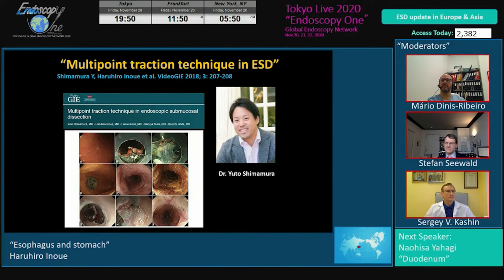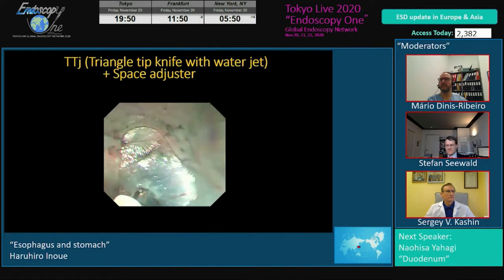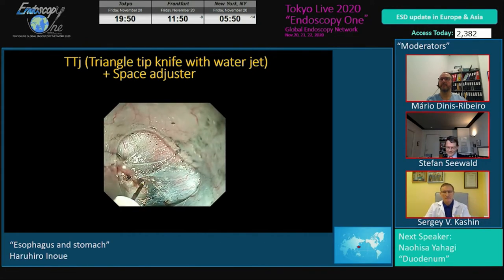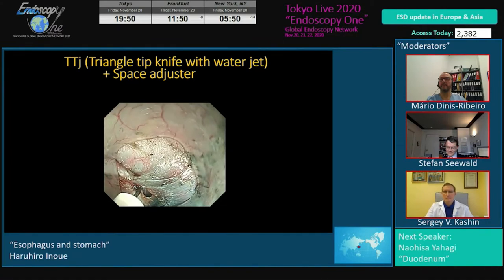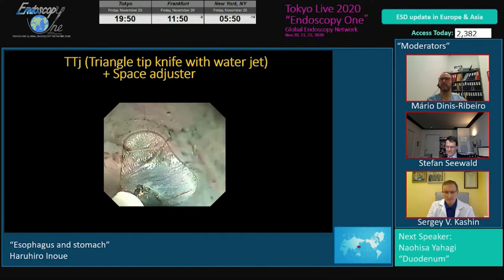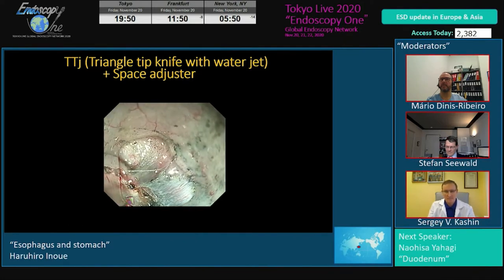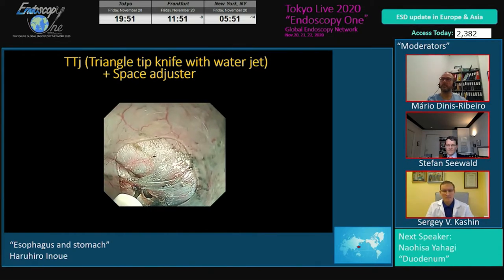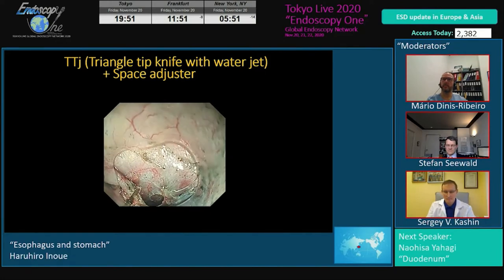Recently, the marked advancement of the ESD technique is using traction. In our hospital, we use a technique of multi-point traction. In our unit, we prefer to use a very soft distal attachment. We call this a space adjuster. This soft cap changes shape, adjusting to the target tissue. When we push the endoscope, we can create a good tension to the submucosal fibers.